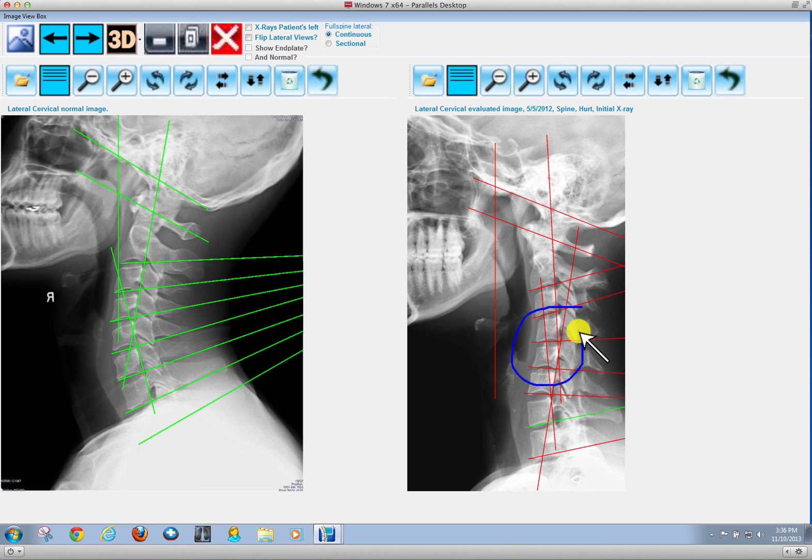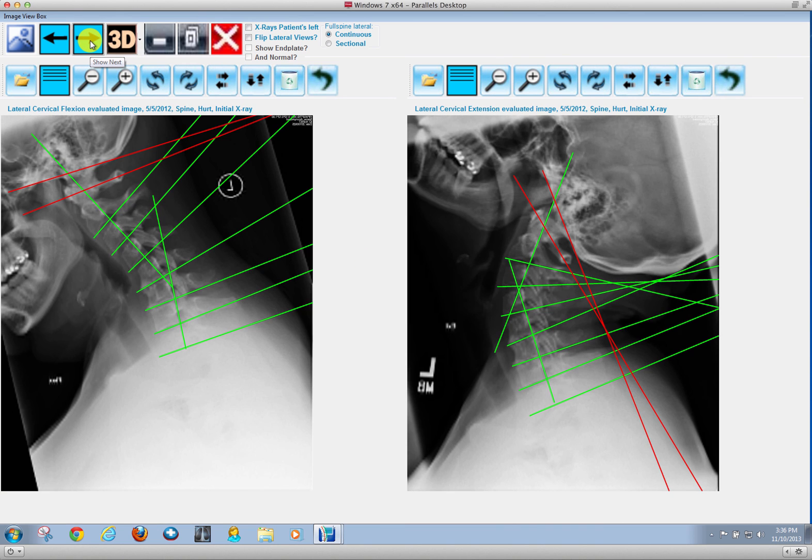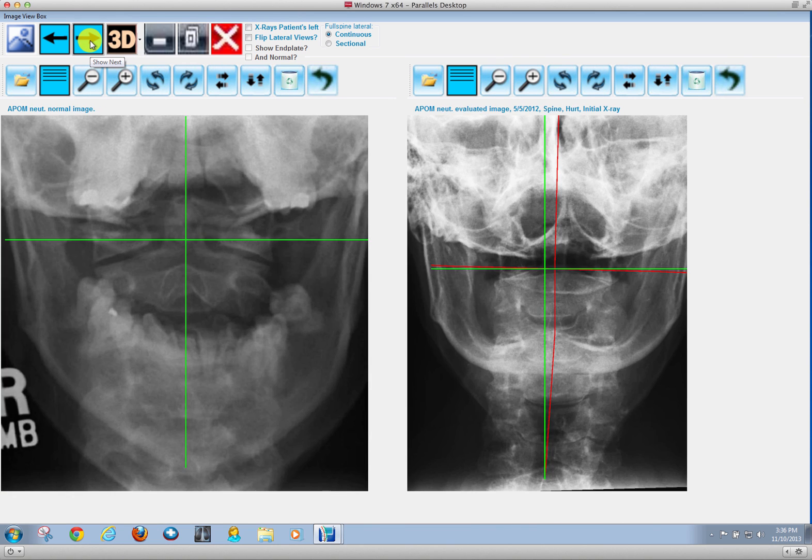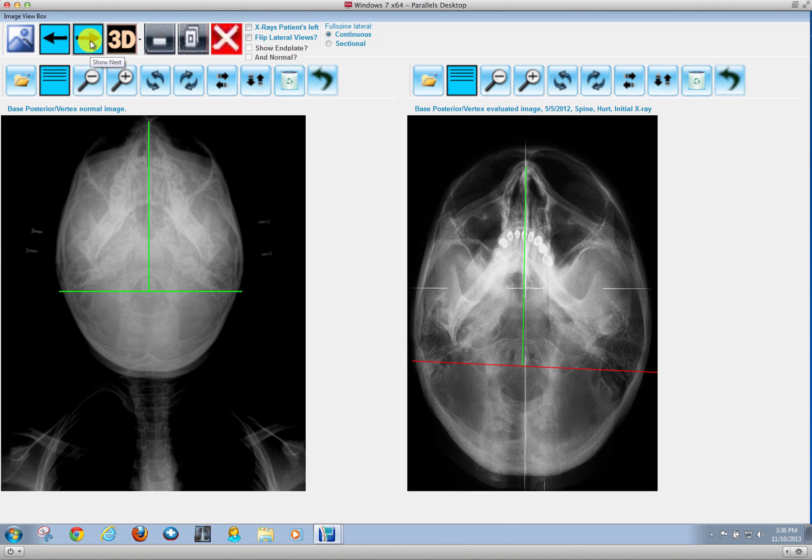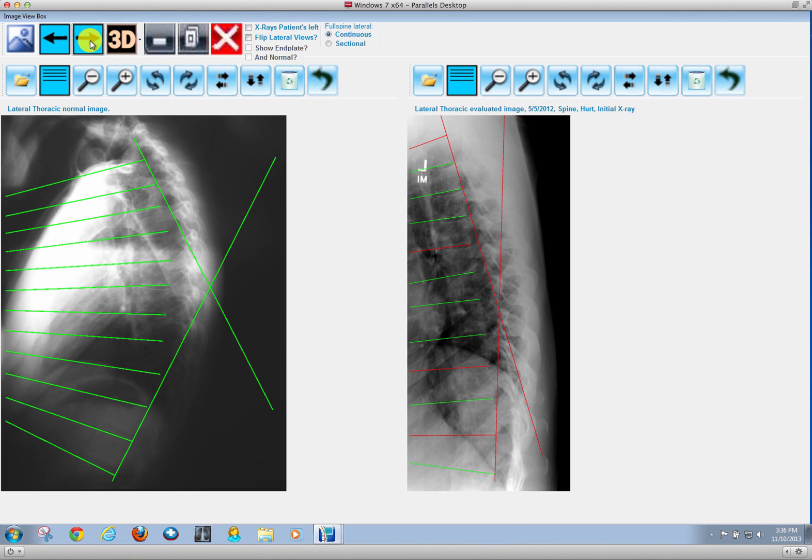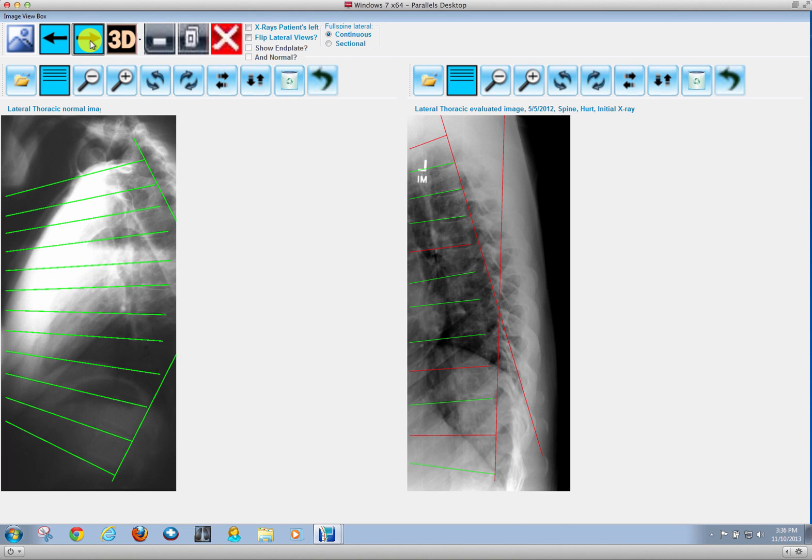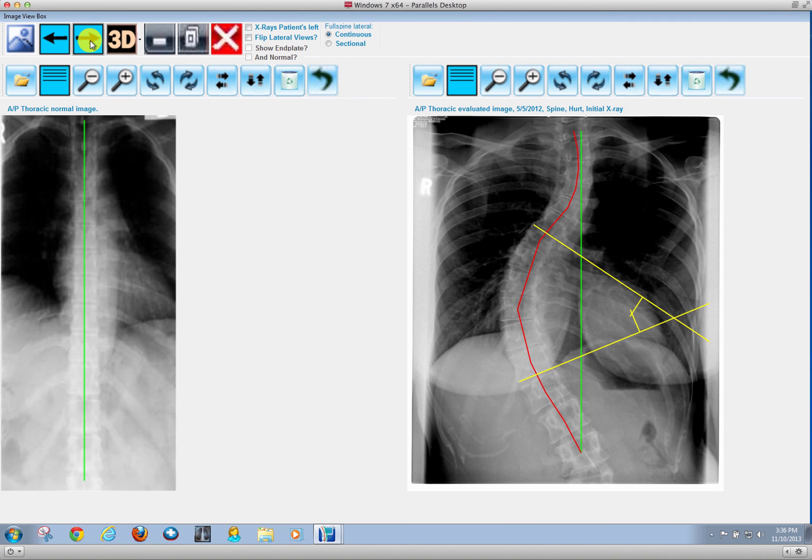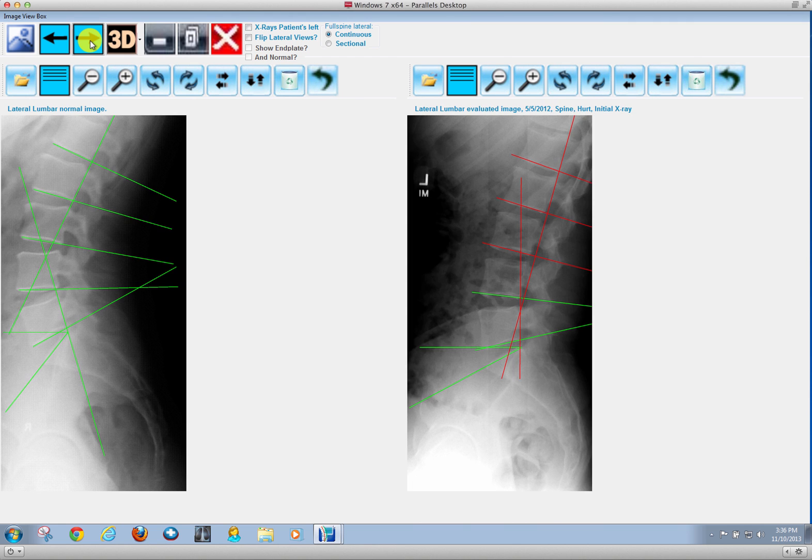We can draw and circle what we need to on the Clear analysis just like we can on the CBP technique. So you have everything that you need to show normal versus the patient using a Clear technique analysis.